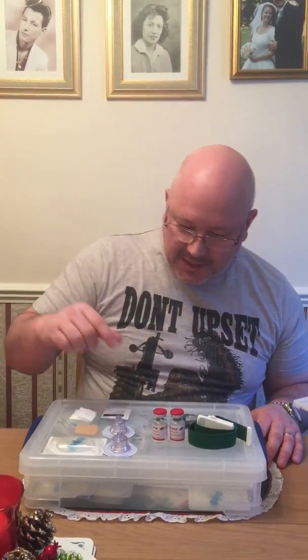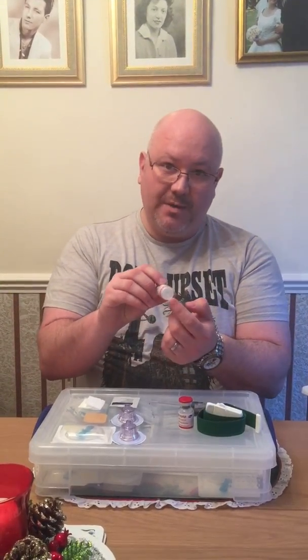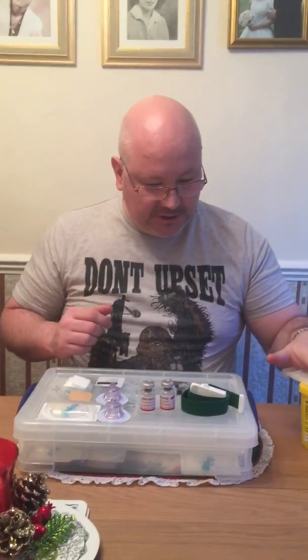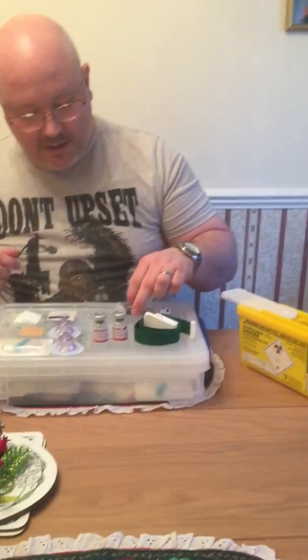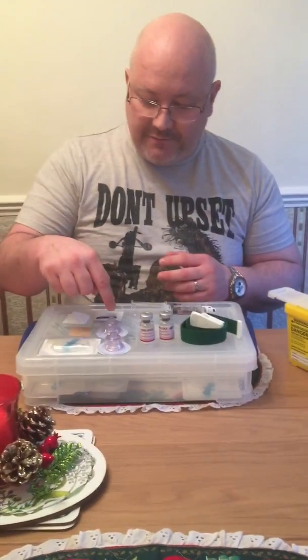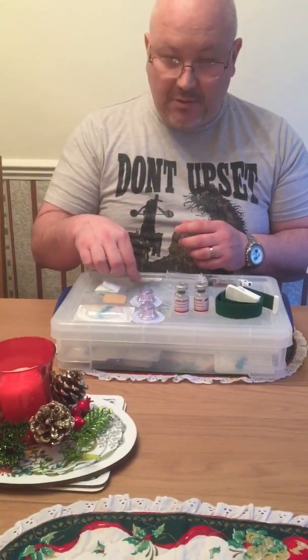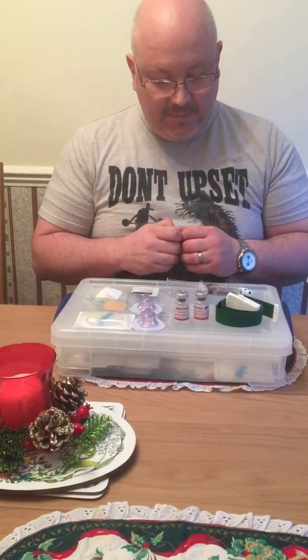The first thing I'm going to do is take the Benefix — this is Benefix recombinant clotting factor 9. You can see the white powder just there. There's 2,000 international units in here, and I'm having 4,000 units, so that's two bottles of 2,000 units. Here's my sharps bin, my tourniquet, my syringes with the distilled water in them, filter needles, butterfly needle, a swab, an alcohol swab, and a plaster.